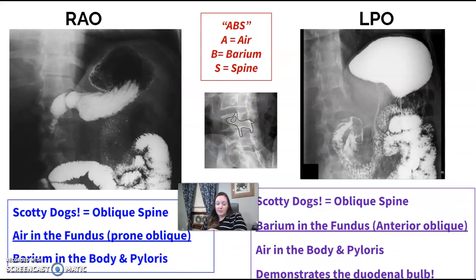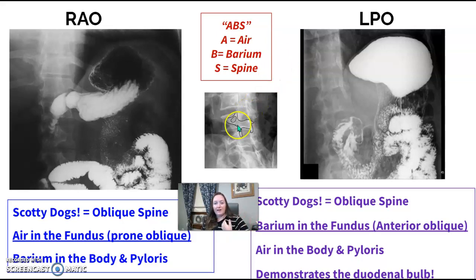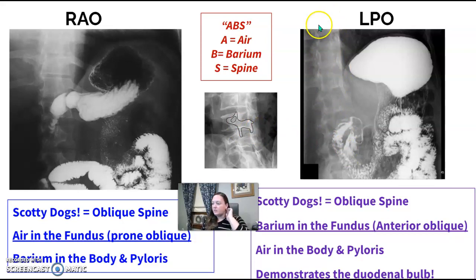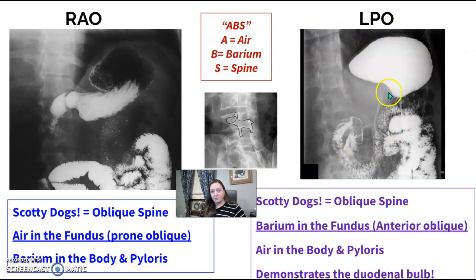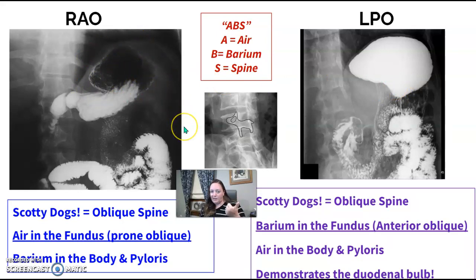For obliques, use the same ABS method — look at spine, air, barium. When you see Scotty dogs in the spine, your patient is in an oblique position, and you won't see spinous processes coming down the middle. The same concept of how barium sits in the fundus applies: when supine, barium sat in the fundus — that's LPO. When prone, air was in the fundus — that's RAO. So with an oblique spine and barium or air in the fundus, you can figure it out.